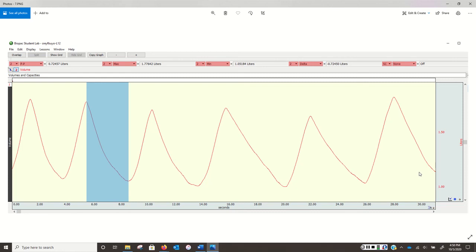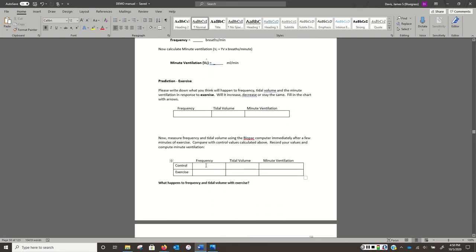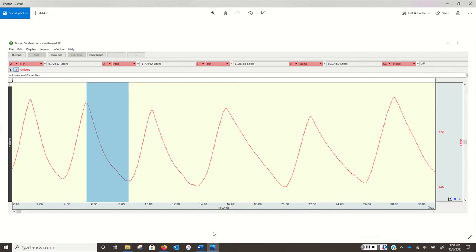And now I'm going to freeze the reading. I'm going to exercise vigorously for 3 minutes, get my breathing rate up. Before we look at that, on protocol 2, we can see it wants you to give a prediction. What do you think is going to happen to frequency? What do you think is going to happen to tidal volume? And what do you think is going to happen to minute ventilation? So go ahead and put down your prediction. We'll fill in the control down here, 12 breaths per minute, 725 milliliters, and 8,700 milliliters per minute. That's my control.